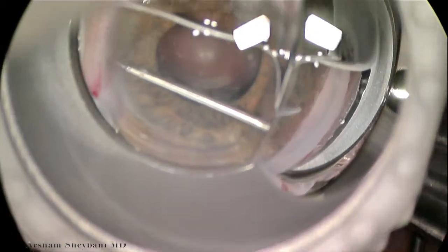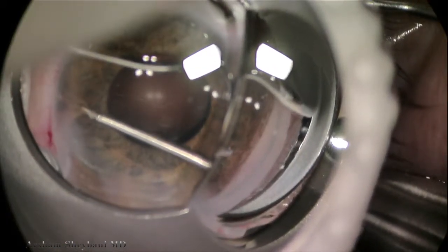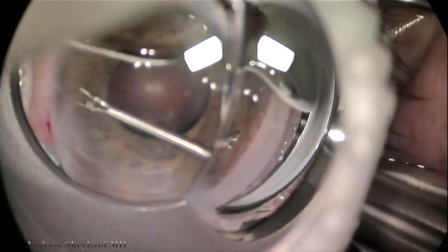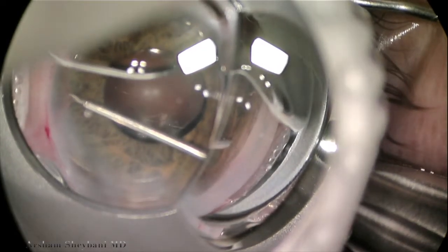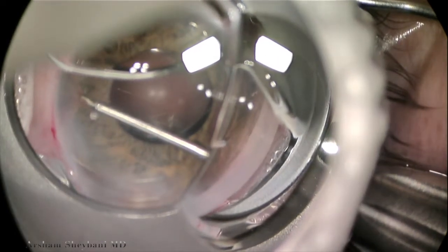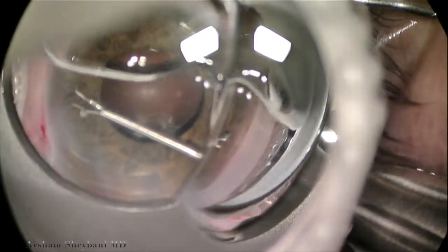As we grab peripheral iris, we gently pull centrally until we see the peripheral anterior synechiae releasing and we can start to see trabecular meshwork. These are pretty high synechiae. You can see two pigmented bands — one is almost like a pigmented Sampaolesi's line, and the one beneath it is the trabecular meshwork.